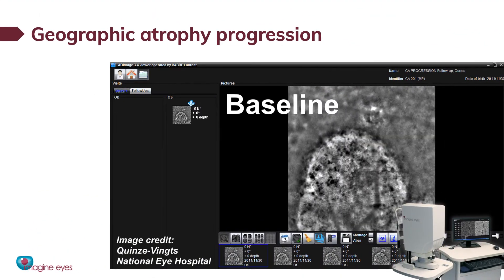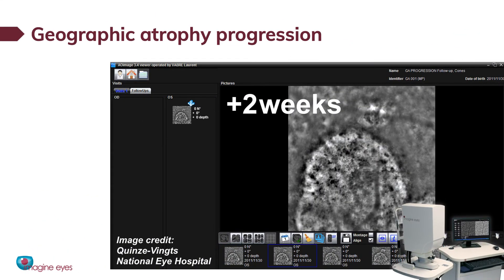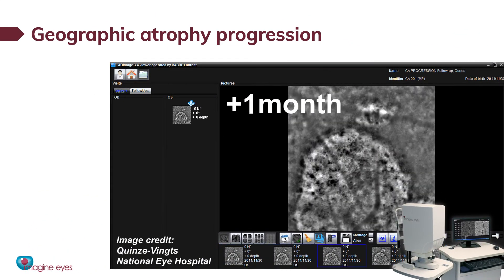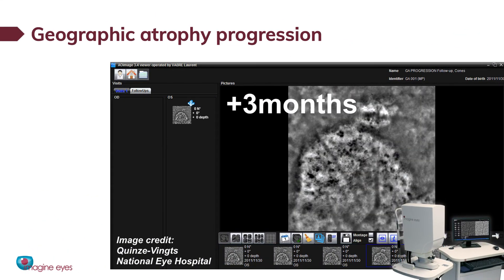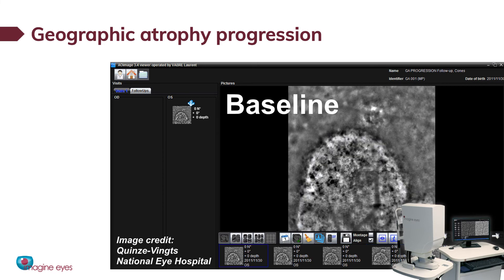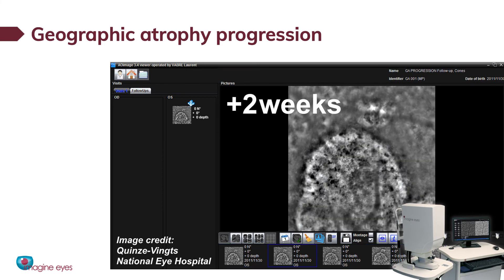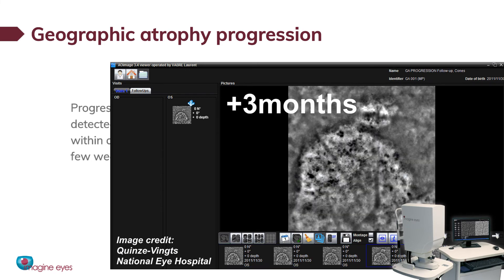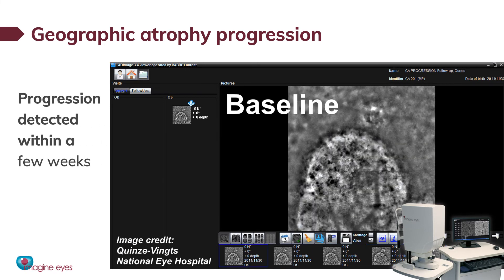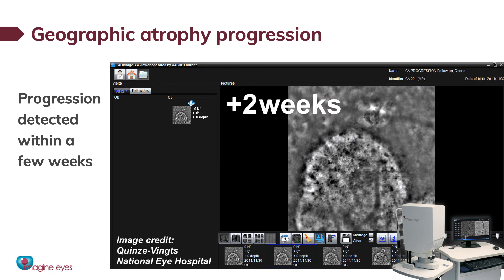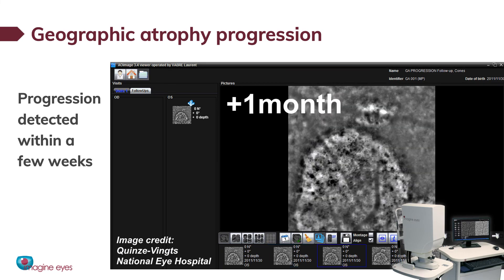In AMD, atrophy progression is usually slow and difficult to assess over short periods of time. With the RTX One, atrophy progression could be detected within a few weeks only.